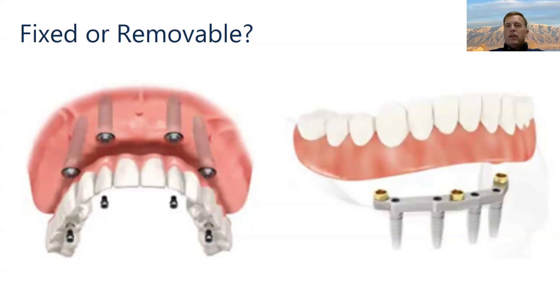Another thing is that there aren't a lot of studies that show this, but a couple older studies that I saw, they did a full fixed and a full removable restoration, let the patient wear both in random order, so it wasn't like they always kept the one they were wearing. And it wound up being about half and half.